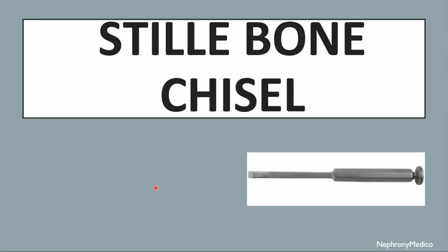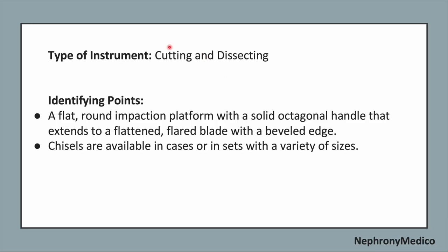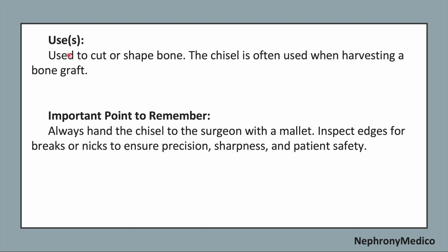Let's talk about the Stille bone chisel. This is a picture showing a Stille bone chisel. Now, it is a cutting and dissecting type of instrument. Identifying points: a flat round impaction platform with a solid octagonal handle that extends to a flattened flared blade with a beveled edge. The chisels are available in cases or in sets with a variety of sizes. Use: it is used to cut or shape the bone. The chisel is often used when harvesting a bone graft.